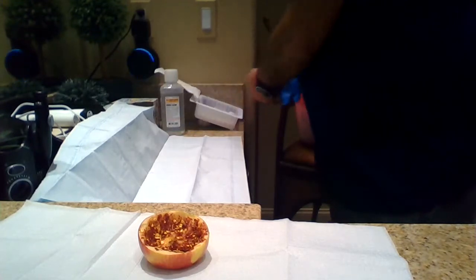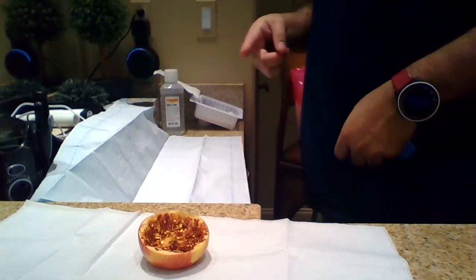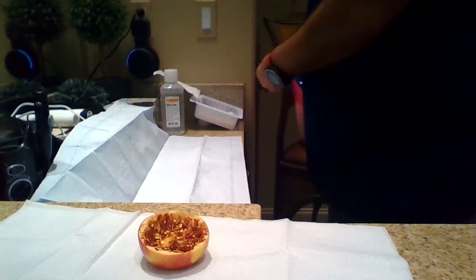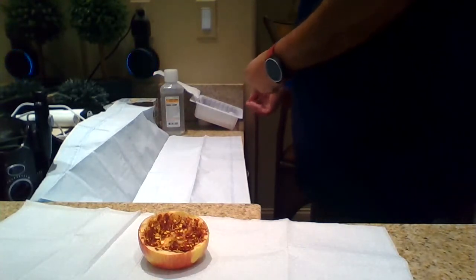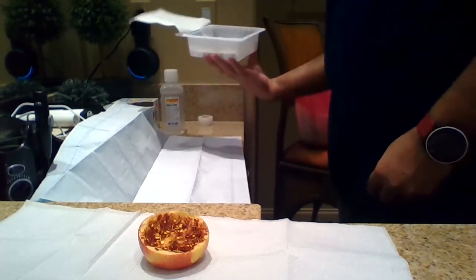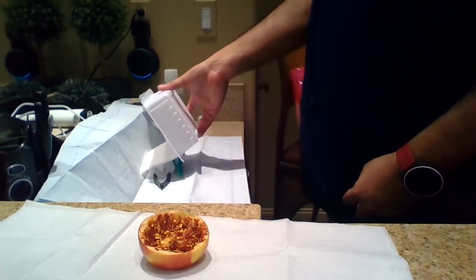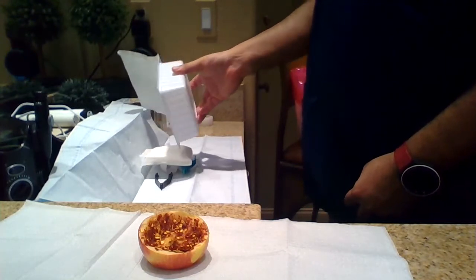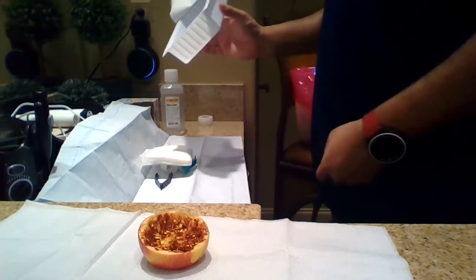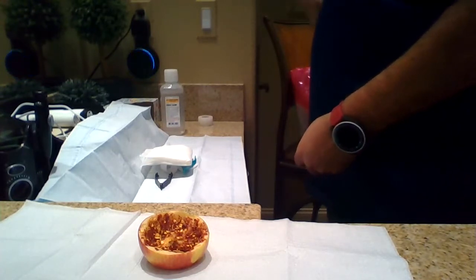And once you have your sterile field, you do not cross with contaminant, or you never turn your back on it, or else that's breaking sterile field. So then, because this is still sterile, I palm it underneath, and then I make sure to put this in the center, keeping my sterile field intact. Nothing touches that plastic except for what's inside here. So this is done with, right here, goes in the biohazard.